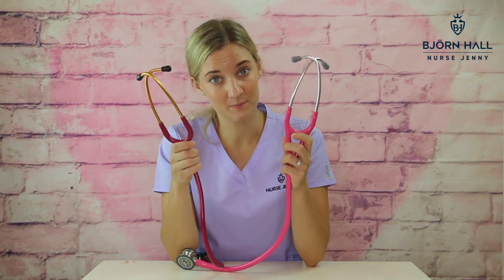Spare kit. With the Classic 3, you will get a set of soft ear tips, a non-chill rim, and a user manual. With the Cardiology 4, you will get a set of soft ear tips, a set of hard ear tips, a non-chill rim, and a user manual. So essentially, just an extra set of hard ear tips with the Cardiology 4.